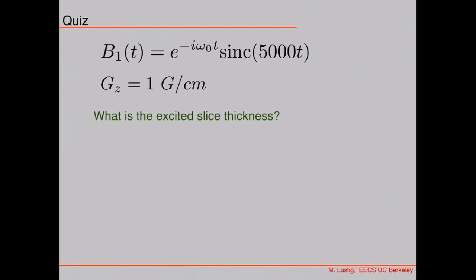And my gradient, GZ, is 1 Gauss per centimeter. So my question is, what is the slice thickness that I'm going to be exciting?